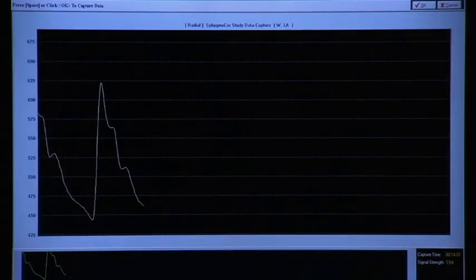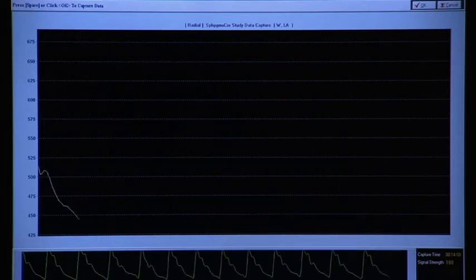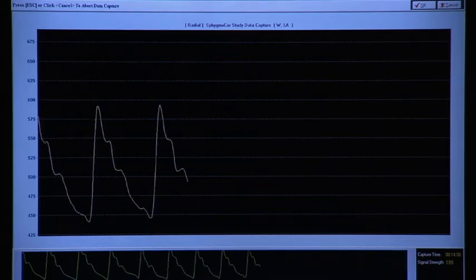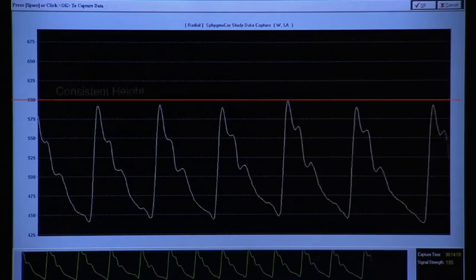The goal in pulse wave analysis is to record about 10 seconds of consistent, continuous blood pressure waveforms, which takes 2 sweeps of the computer screen. The waveforms should be tall, filling at least half the screen. They should be of consistent height. The peak of each wave should be near the same vertical position on the screen.